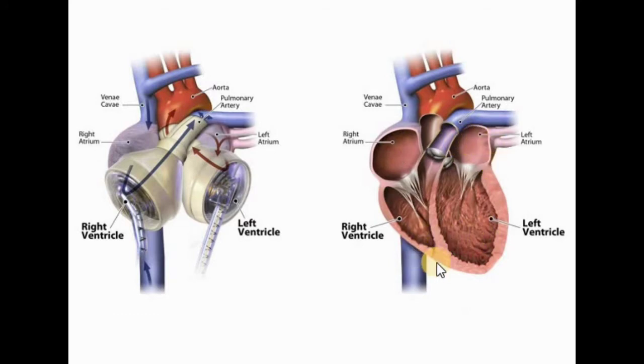So these ventricular assist devices are used in this lower section of the heart, which is the ventricle. If it is used in this left portion, it is called a left ventricular assist device. Also, if it is used in this right portion, that device is called a right ventricular assist device. So this is an illustration in order that you may know more about it. Now let's move on to types of ventricular assist devices, but we have already illustrated from this diagram.